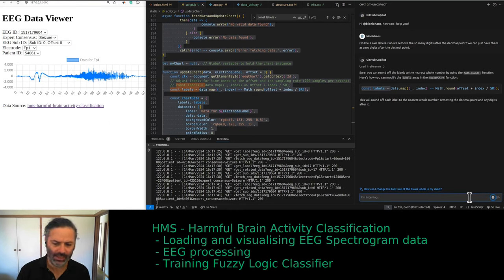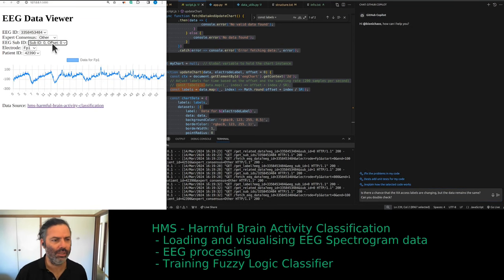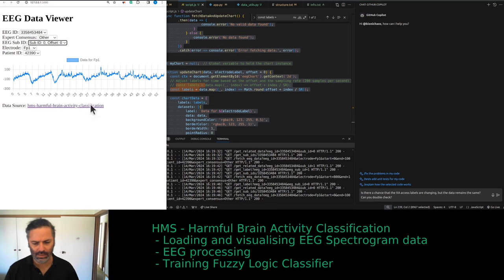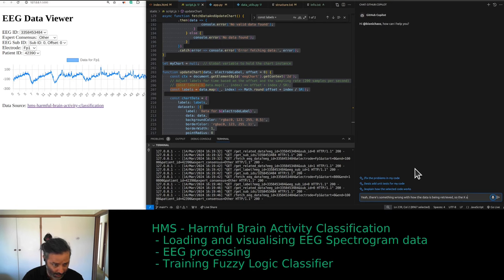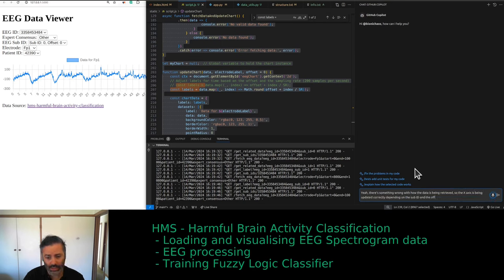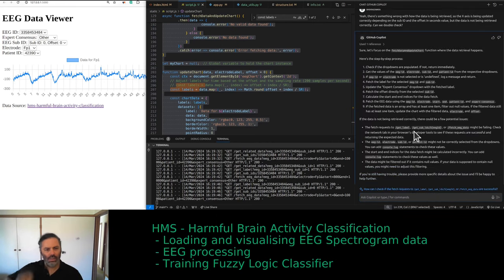There's a chance the x-axis labels are changing but the data remains the same. The data is exactly the same. There is something wrong with how the data is being retrieved. The x-axis is being updated correctly depending on the sub ID and the offset in seconds value, but the data is not being retrieved correctly.